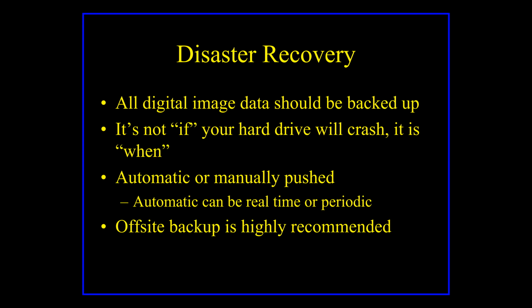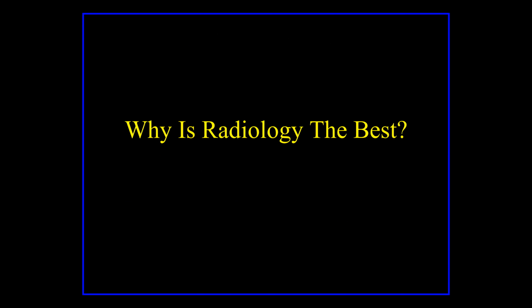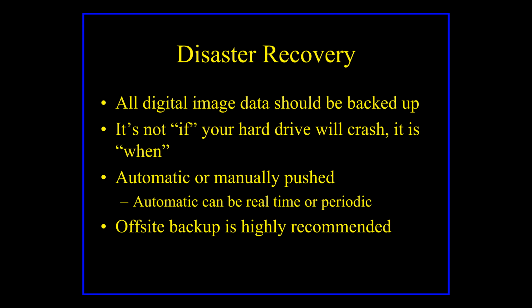Okay. And so you want to be able to back up those images just like you do with your computers at home. You can back them up to different file services. You can put them on a portable hard drive that's in your clinic. You can back them up to the cloud. That all works really well. And you can do the same thing with DICOM images, but if you do it that way, once you back them up, you can't search for them. You can't just say, I want to go find Fluffy Jones, because the file names are scrambled.